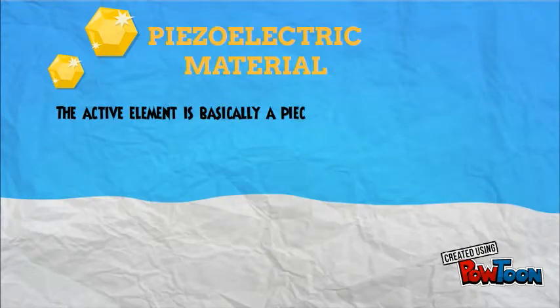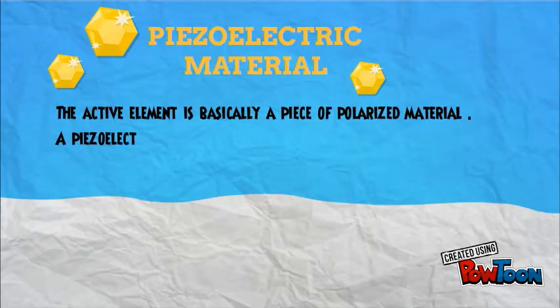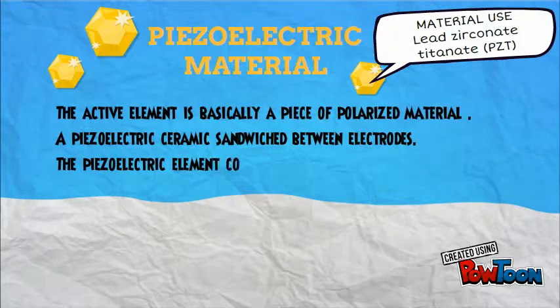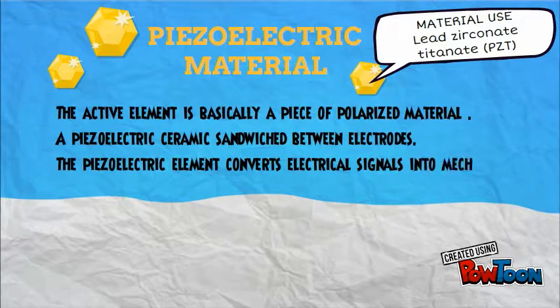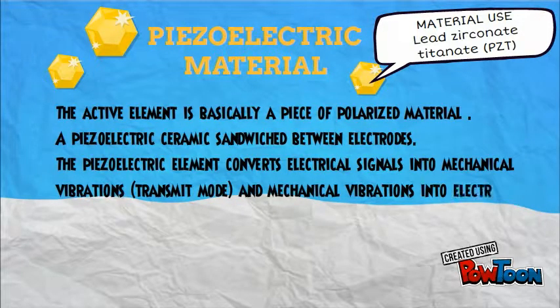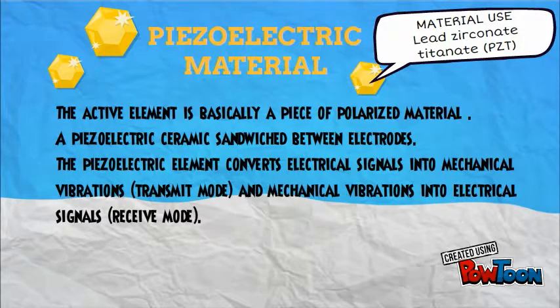The material used is lead zirconate titanate. The active element is basically a piece of polarized material. It is sandwiched between the electrodes. The piezoelectric element converts electrical signal into mechanical vibration and mechanical vibration into electrical signal.